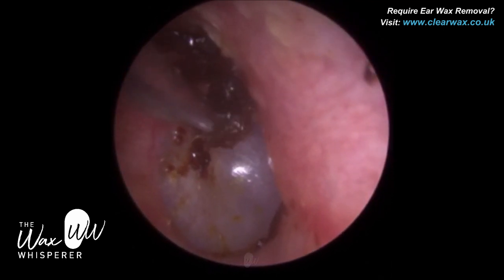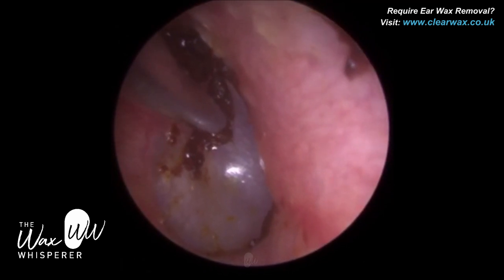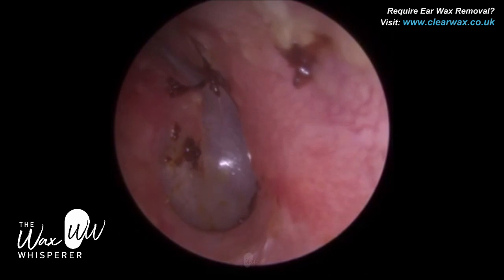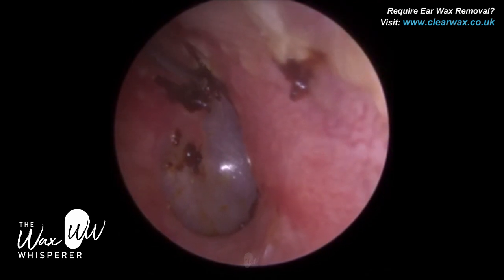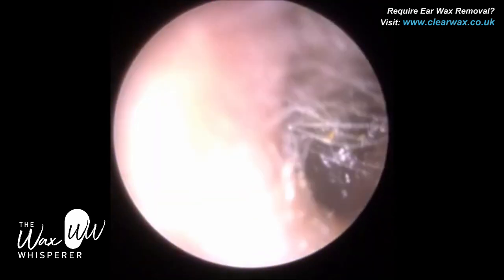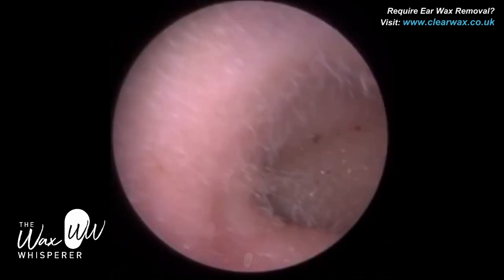Just using the fine end curette. And because the wax is really deep and it's on this anterior wall, within the anterior recess, I've had to bend the tip of the fine end to get around the canal wall. Just removed a bit of wax from the roof of the ear canal as well.